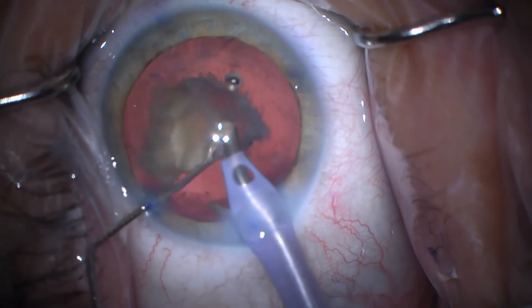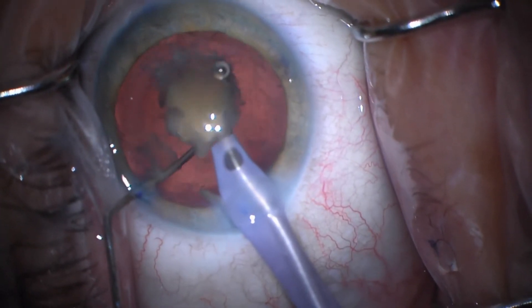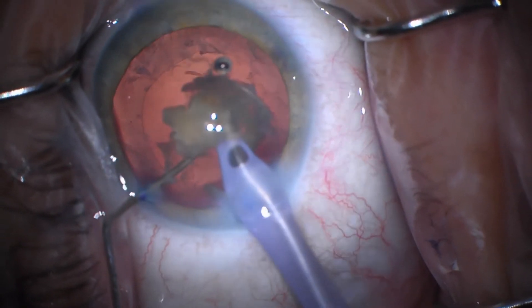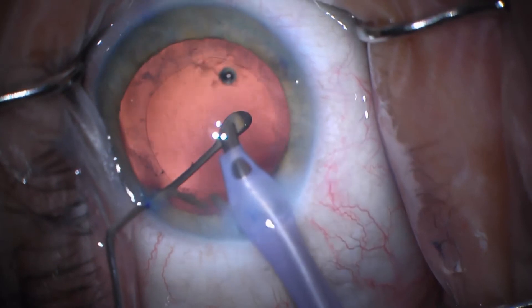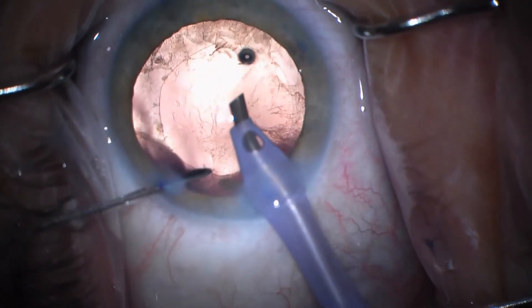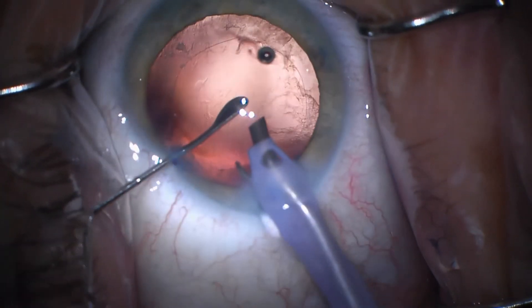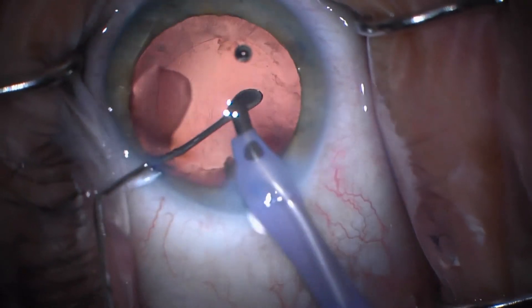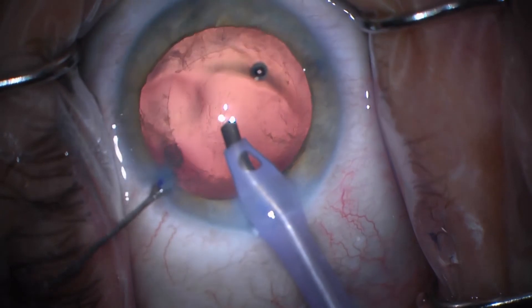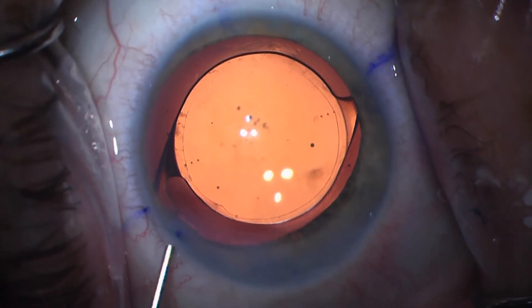Eventually it comes. I've got the second instrument in here — I might as well protect with it. But watch: because I'm using the second instrument to protect, pieces are attracted to the paracentesis. Little bits are going over to the paracentesis — you can see they're going to the sub-incisional space. Now there's a piece that's stuck there. Watch what happens here — this is very instructional. I'm going to move this piece away from the sub-incisional area, but it goes right to the paracentesis because fluid is going out through the para. So I'm going to have to push it back in. There's a tax associated with using the second instrument.